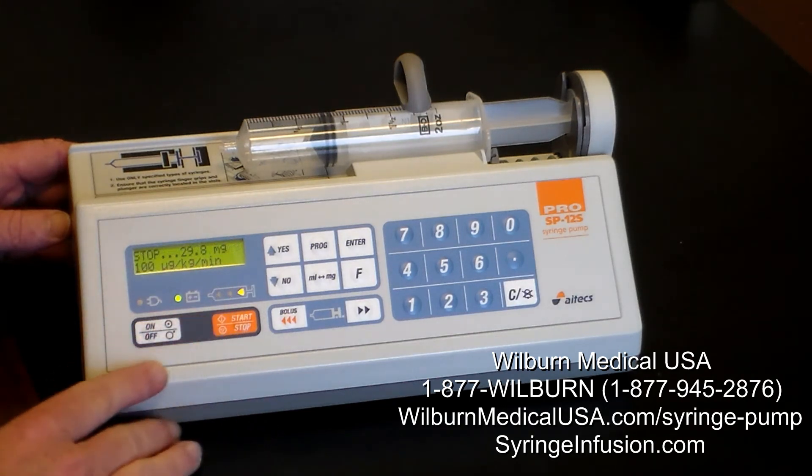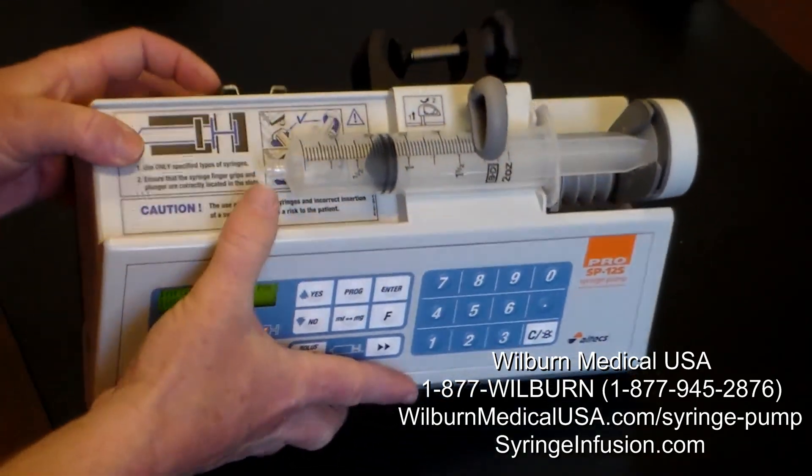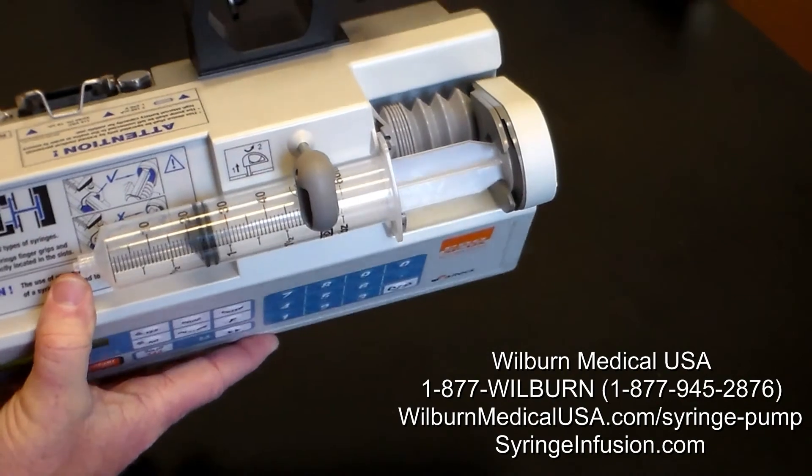If I need to stop it for whatever reason, I can start it back up easily. The device can be used as tabletop, and we have a pole mount built at the back where you can mount the pump itself to the IV pole.